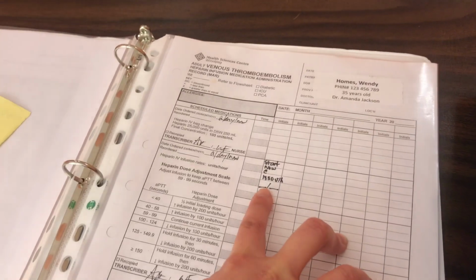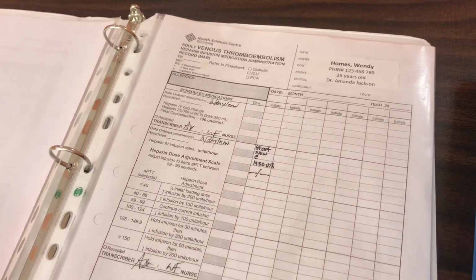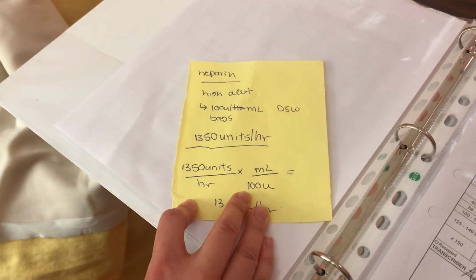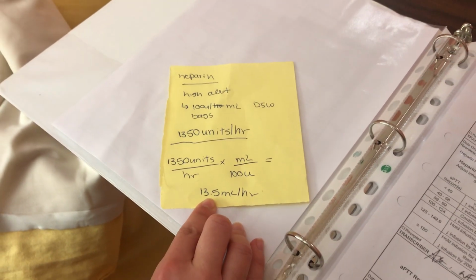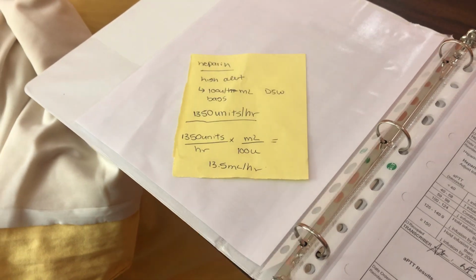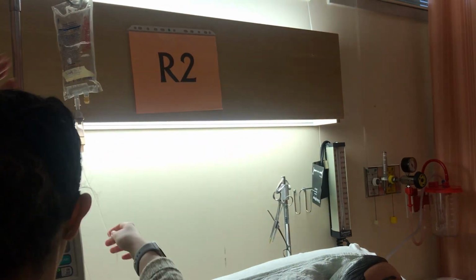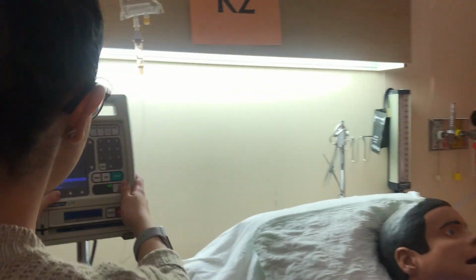The order is to give 1,350 units per hour. So for my calculation, because the concentration is 100 units per ml, that's going to be at a rate of 13.5 mLs per hour. So I have the right drug, the right route via IV, the right time, it is due now. And I'm going to go ahead and start putting this into my pump.